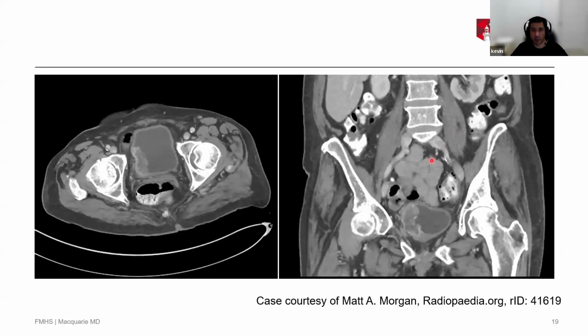So for instance, if you want to image the vessels, like the artery just here, you want to image it at about 25 seconds. And if you want to image the kidney well, then the kidney has multiple different phases. So if you look at this kidney here, the cortex opacifies at this point. The less dense bit here is the medulla. So you can give a cortical phase, a corticomedullary phase. If you wait long enough, it starts excreting contrast, which we'll see in a moment.